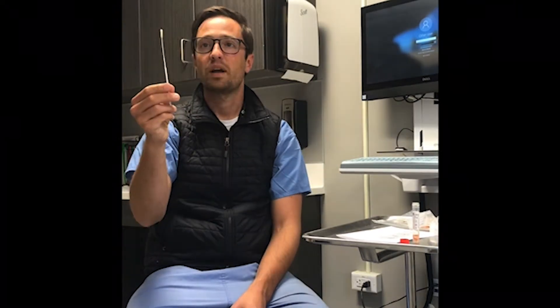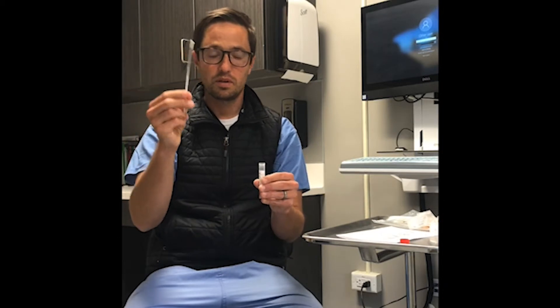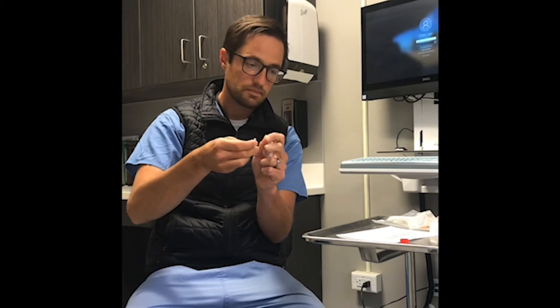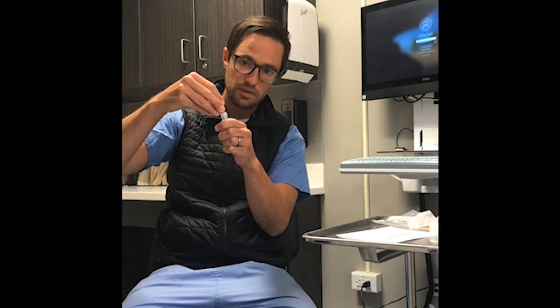After about 15 seconds, take the same swab and use the opposite side. Now, again not touching the cotton end of the swab, gently return the swab to the collection vial. Break off the top at the score line and then cap the sample.